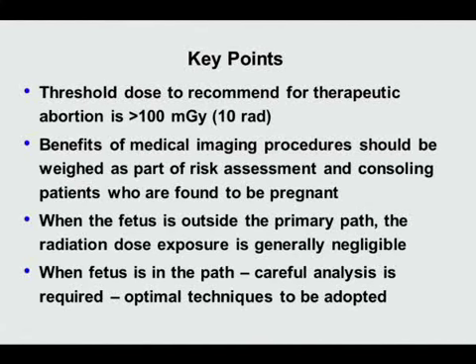When the fetus is outside the primary path, the radiation dose exposure is generally negligible. So we as physicists can be very comfortable making a statement that if the fetus is not directly in the beam, the radiation exposure to the fetus is insignificant. It's very small, and the imaging procedure should not be stopped. When the fetus is directly in the path of the beam, careful analysis is required, and all possible optimal techniques should be adopted.